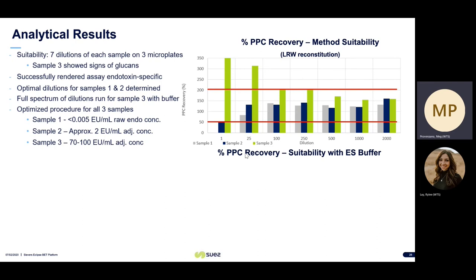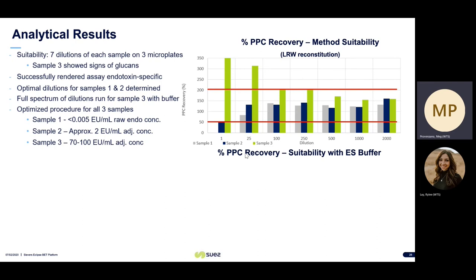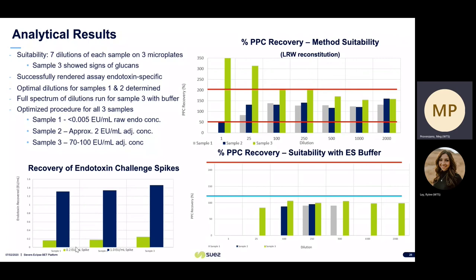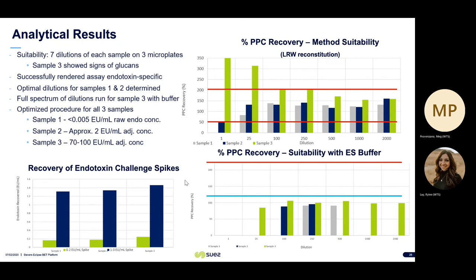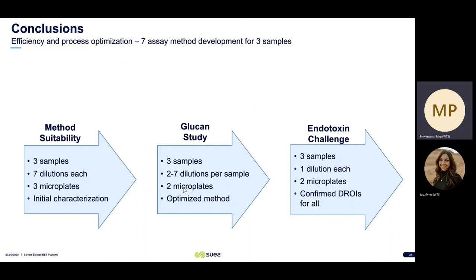Here you can see the percent PPC recovery using LRW to reconstitute the lysate. The 50 to 200% range is shown, and sample three is typically very high, which indicates glucan contamination. With the endotoxin-specific buffer, the PPC recovery is much lower for each sample. Here's a graph showing the recovery for endotoxin challenge spikes — each sample was challenged with a known amount of endotoxin concentration, and each was able to recover around what they were spiked at, within the 50 to 200% range expected for a biological assay.